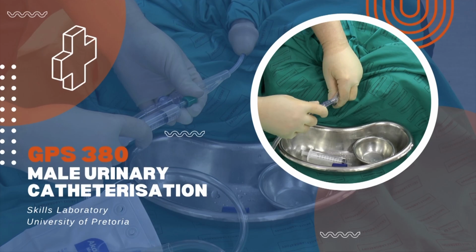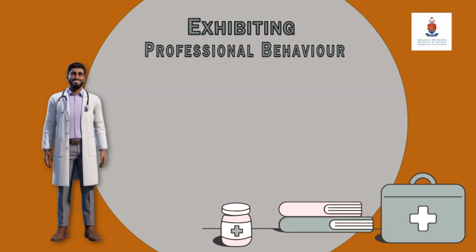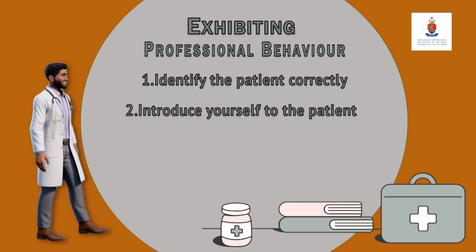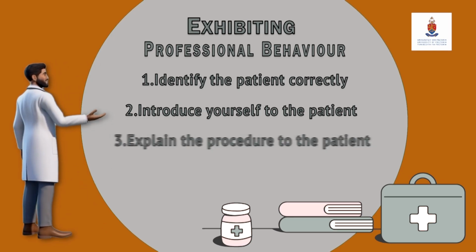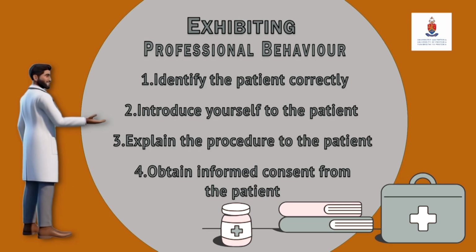Male urinary catheterization. Exhibiting professional behavior. Before starting with this procedure, make sure to identify the patient correctly. Introduce yourself to the patient. Explain the procedure to the patient. And obtain informed consent from the patient.